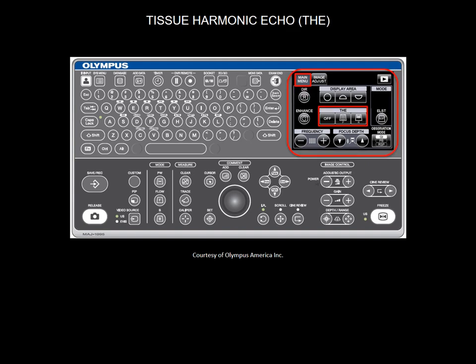Tissue harmonic echo appears on the touch panel only on Premier Plus processor. It is a technology designed to improve conventional gray scale image quality. It improves resolution, signal-to-noise ratio, and reduces artifacts such as reverberation.